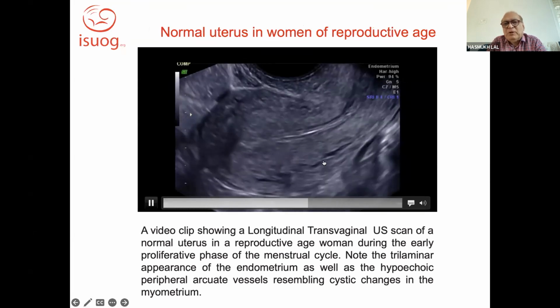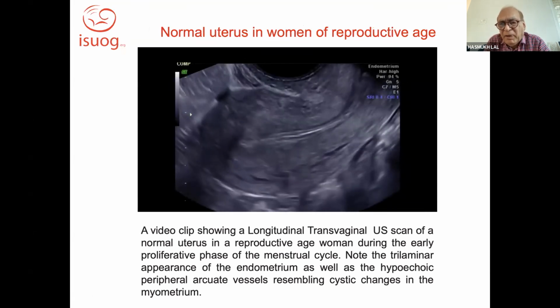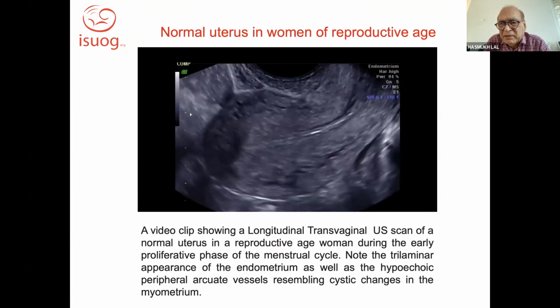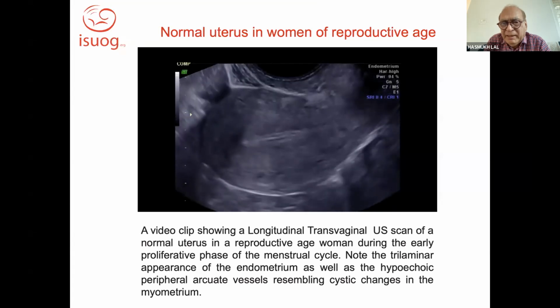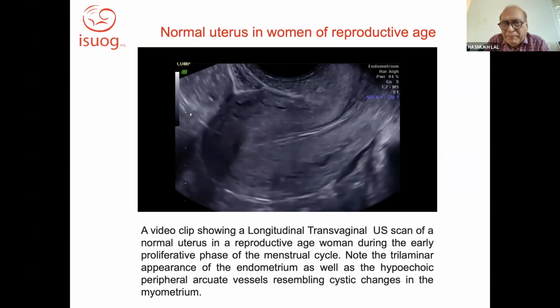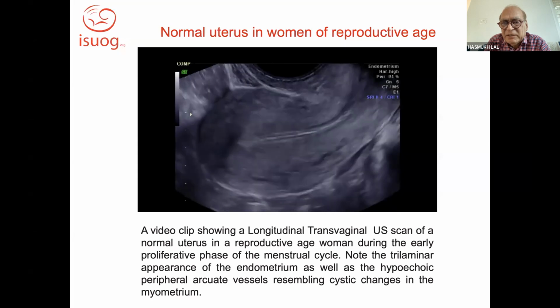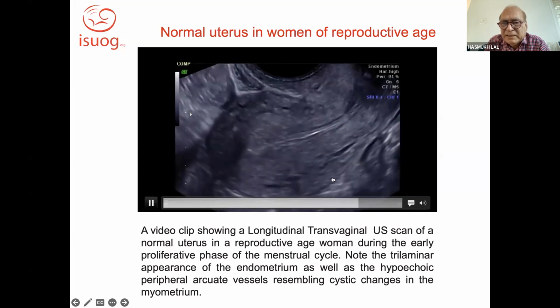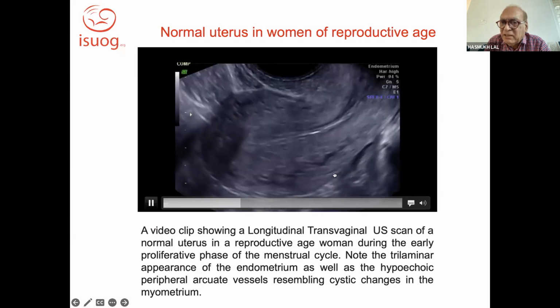In case of deep endometriosis, this is very helpful, because a lot of women complain of pelvic discomfort, heaviness, and pain. On just trans-abdominal scanning, we will see nothing. And this sliding sign will tell us that there is adhesion, or sometimes we see some hypoechoic region in between these two places.